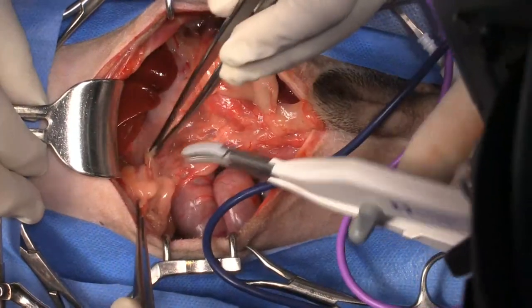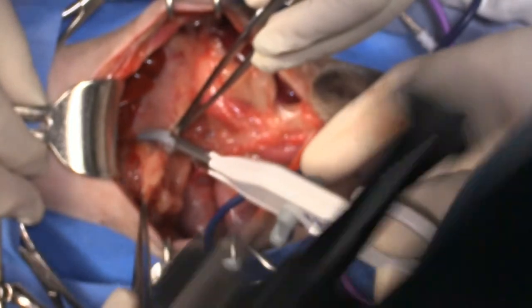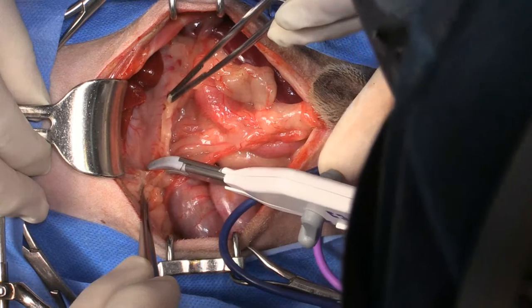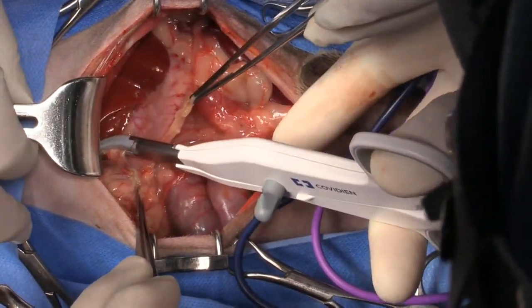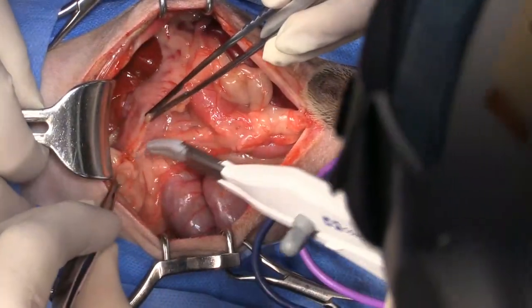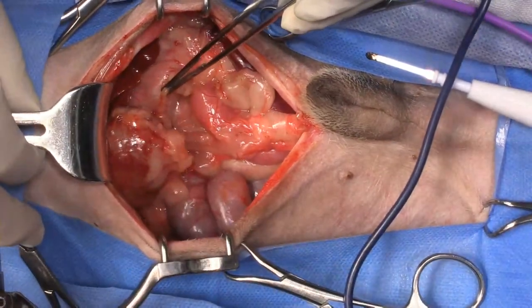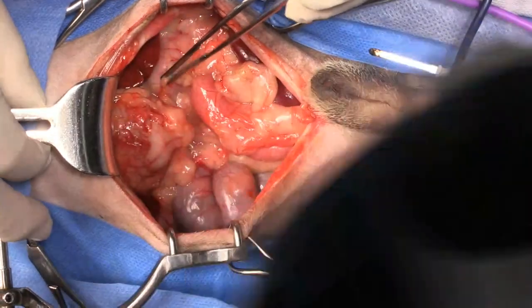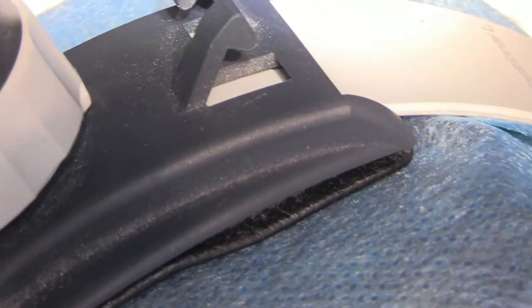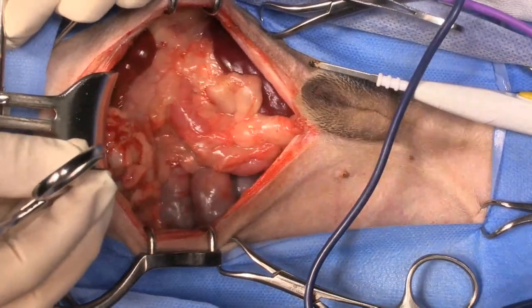Emily, are you happy up front? So we've got it on a dopamine CRI to try to get our blood pressure up. So that's stomach there. We've just had Sarah Austin join us, and we've got some adhesions. And we're also waking up a little bit. So we're battling hypotension and making sure the anesthetic is at high enough level to keep the patient asleep. So it's always a battle. In this case, it's more of a battle than usual.